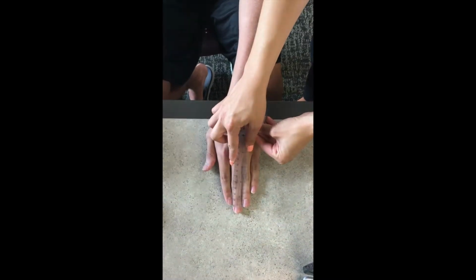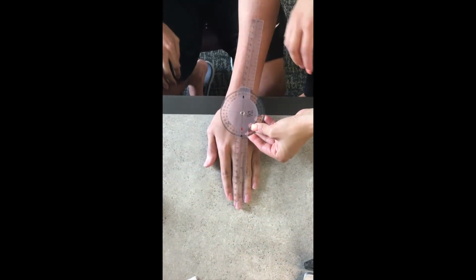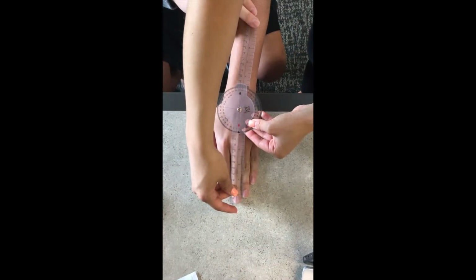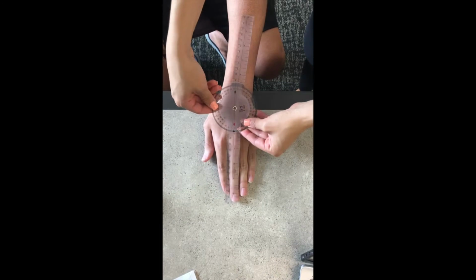The first test was ulnar deviation range of motion. Have the subject put their hand flat against the table. The stationary arm bisects the radius and ulna. The mobile arm follows the third metacarpal, and the axis of rotation is the capitate.